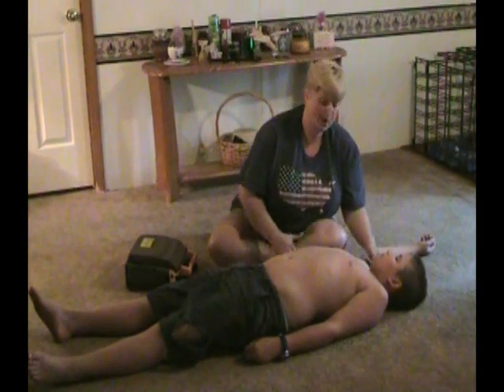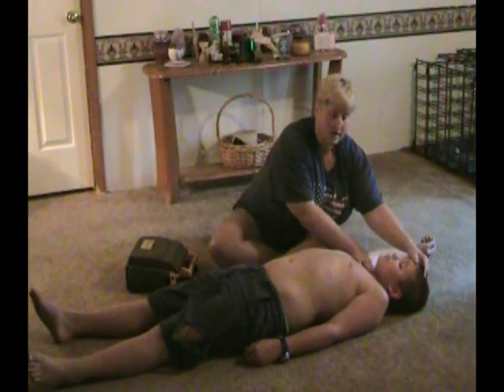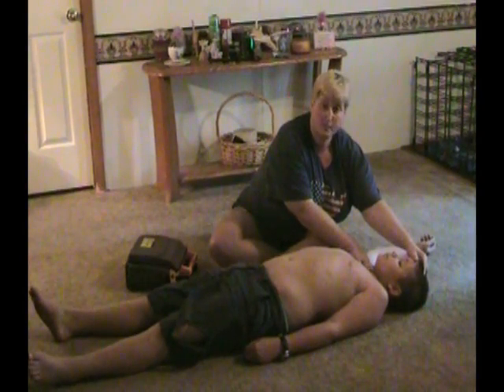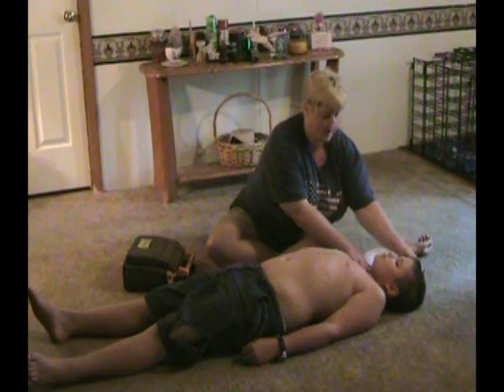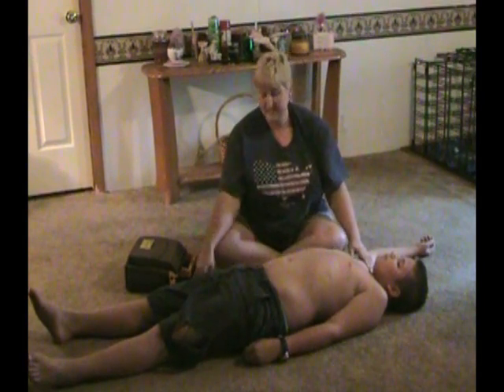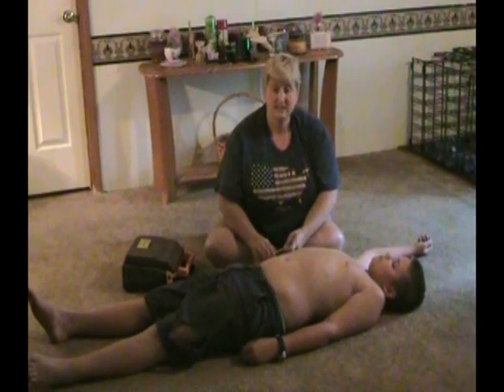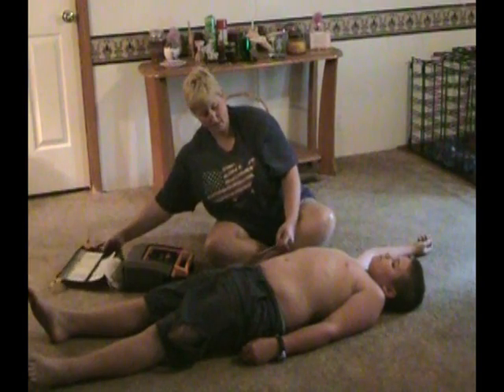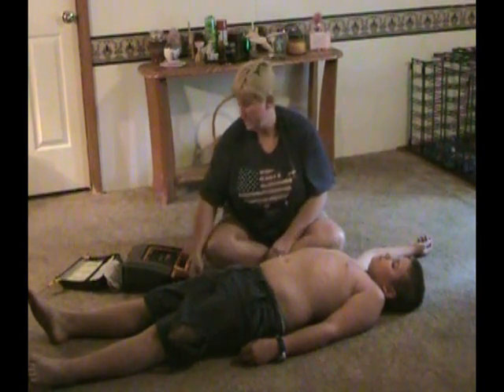Next, you would check for a pulse. This is done on the carotid artery on the victim's neck. You'll check to see if you feel a pulse. When checking for breathing and pulse, do this for no longer than 10 seconds. Once it has been established that the victim does not have a pulse, this is an indication we need to use the AED. We need to apply the AED using the proper steps.